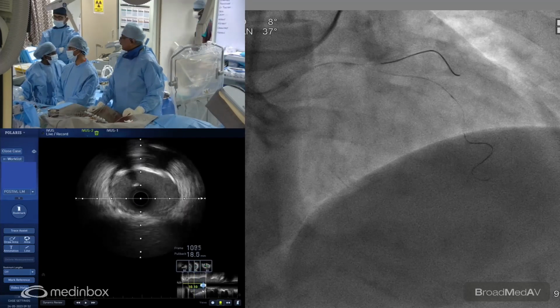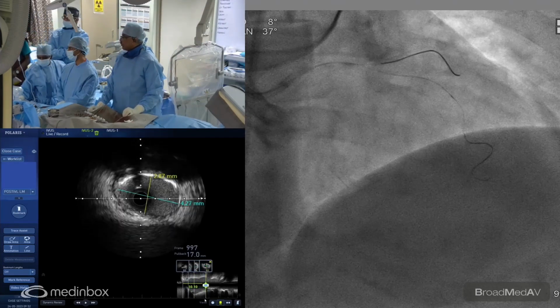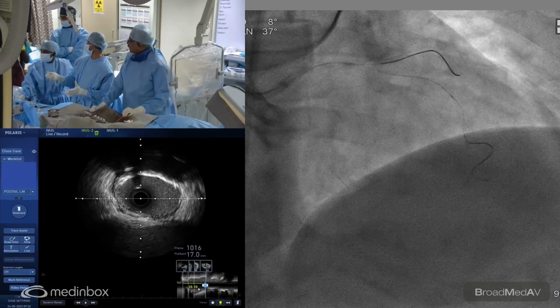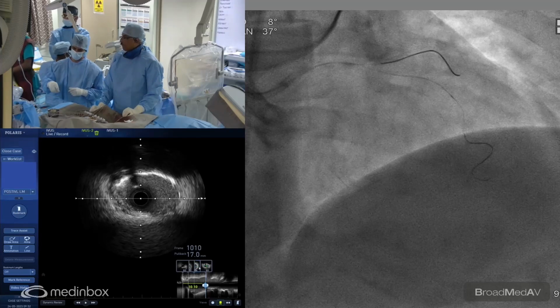Okay, so the idea is, because it's negatively remodeled at the left main ostium, I don't want to go up much higher there. Maybe you can use a short 4.5 or 5.0 just to do the distal. Open up the 4.0, please. Onyx 4, yeah, 12.